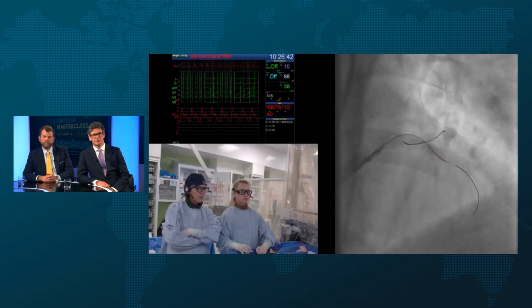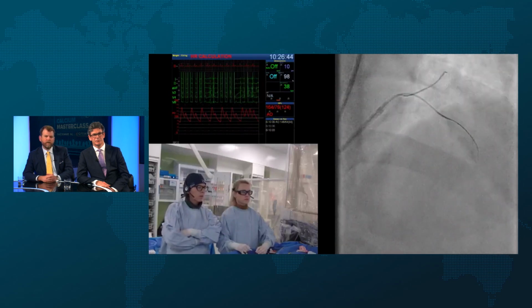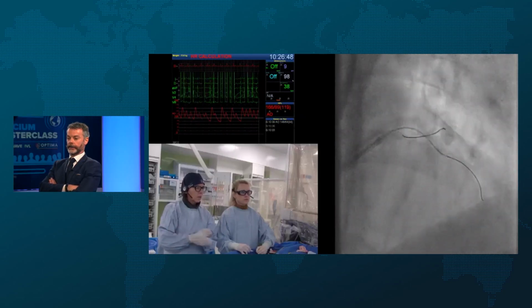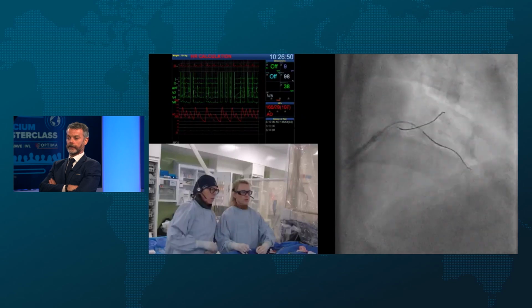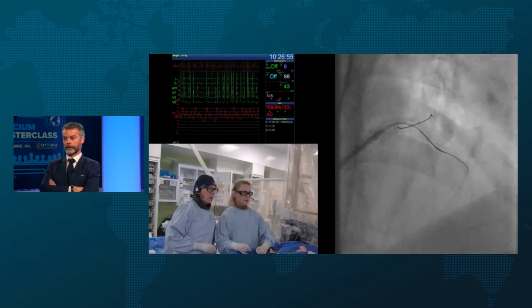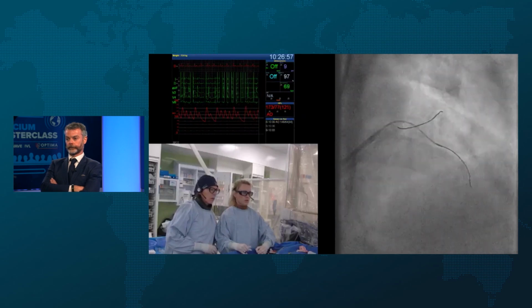Yeah, I agree, Rob. That's what I was going to suggest as well. A really big septal, and actually, as Margaret said, there's a very high-grade lesion immediately after the aneurysm. So it's trying to localize on that. It's pretty difficult with the wire floating about in it. Yeah, it can be a real challenge.